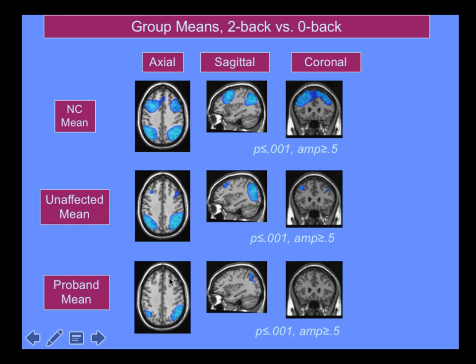The patients with schizophrenia fail to activate the LPFC, even though they're still attempting to do this task. And what was interesting, because what we were really looking for was an intermediate phenotype to be able to do a genetic study on this, was that the unaffected siblings of the patients fell somewhere in between. This could be done straightforwardly with fMRI, but we were able to do it with MEG, and then look at some of the time courses of this data. It's an example of an early, very basic neuropsychiatric study we did in schizophrenia.